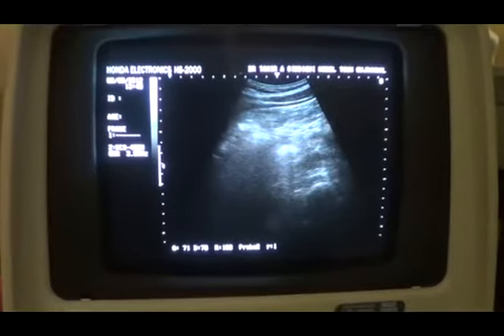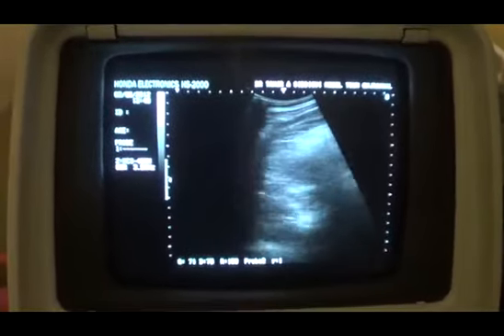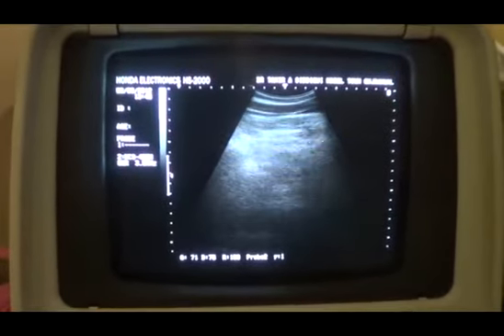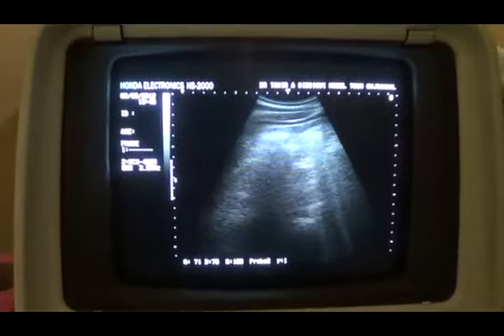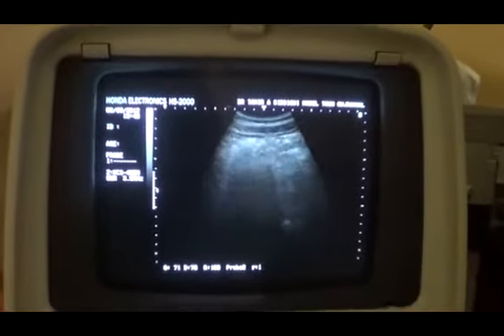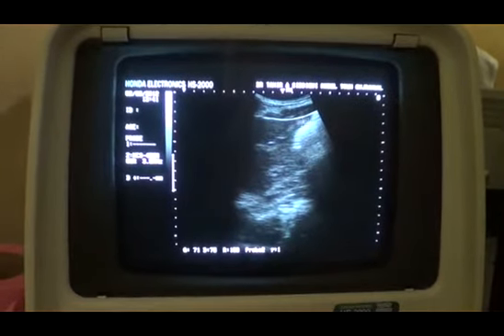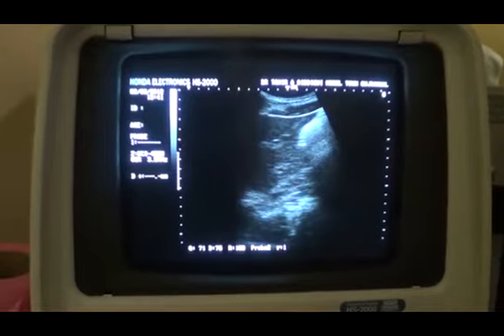This is a subcostal view of the liver to see if the liver is seen below the costal margin. I am moving the probe in the subcostal region, so except bowel gases I don't see liver parenchyma. So the liver is not enlarged. Here comes the left lobe of the liver. We can see that the angle is sharp, the outer surface is smooth.